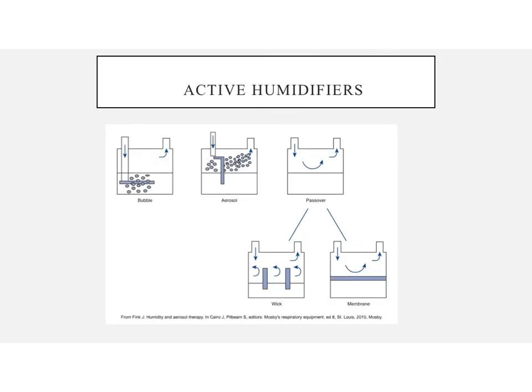So here we have the humidifiers that we've talked about so far. So we have the bubble humidifier that we went over. The gas would come in here, and this diffuser of mesh or foam breaks it up into bubbles, so it goes under the water and comes back up to the patient. We are going to go over large volume nebulizers and aerosol nebulizers in a little bit.